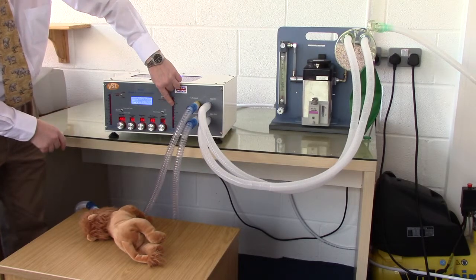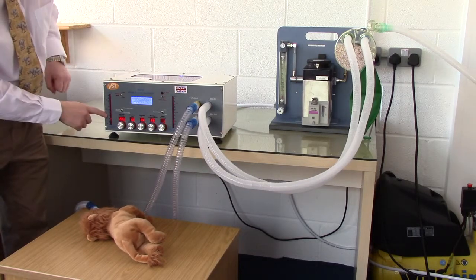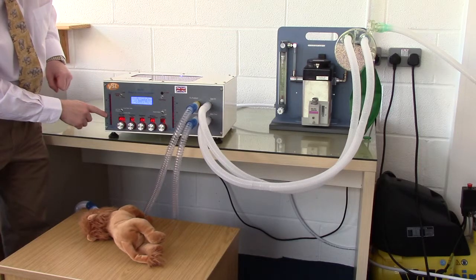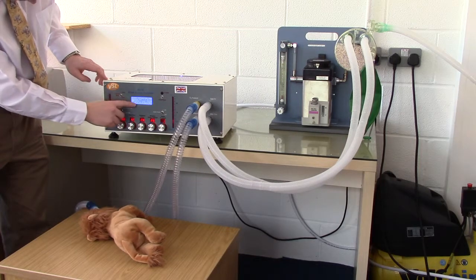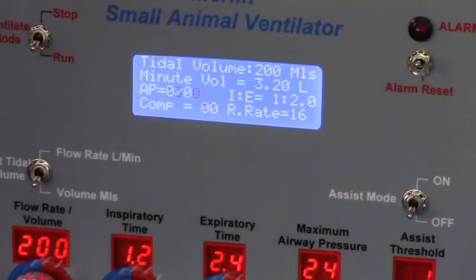See the inspiratory pressure rise on the right-hand side, and the expiratory port pressure rise on the left-hand side. On the screen are all the parameters of ventilation. The tidal volume is set to 200mls, and the minute volume is 3.2 litres, because the respiratory rate is 16 breaths per minute.